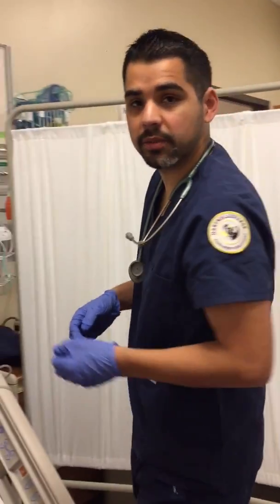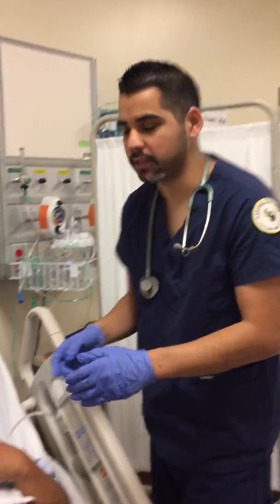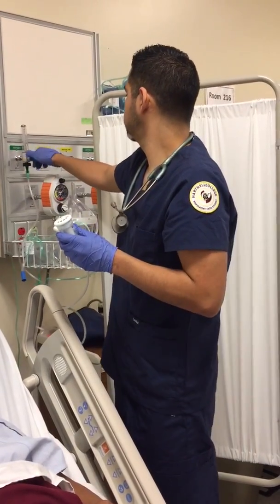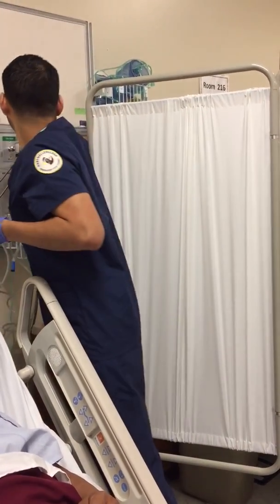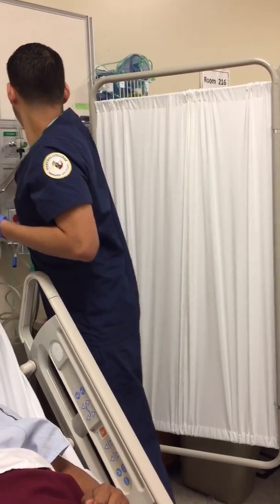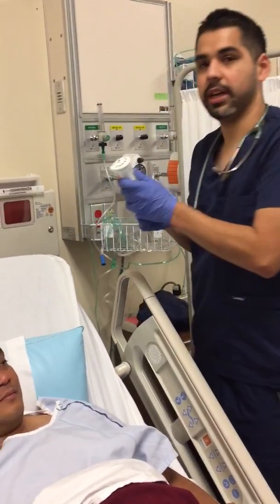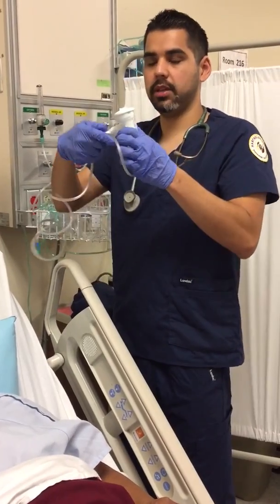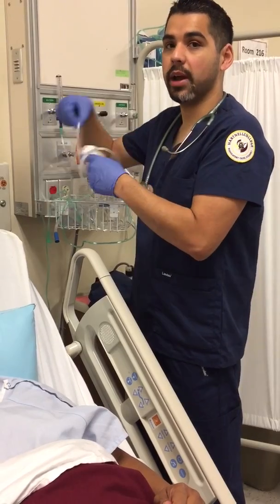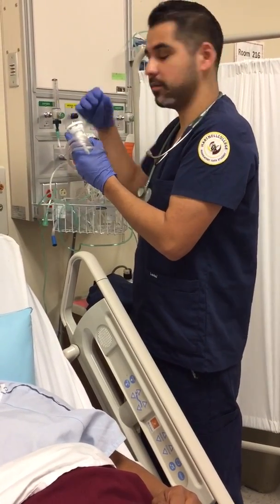Okay, so 10 minutes have gone by, and the medication has stopped in those 10 minutes. Okay, thank you very much, Richard. I'll take that. So again, I would be wrapping this up in the bag, and then putting it back in a clear bag, the way he got it.